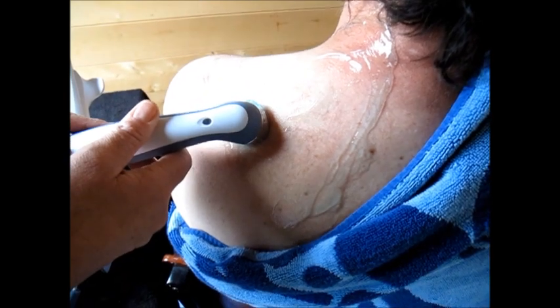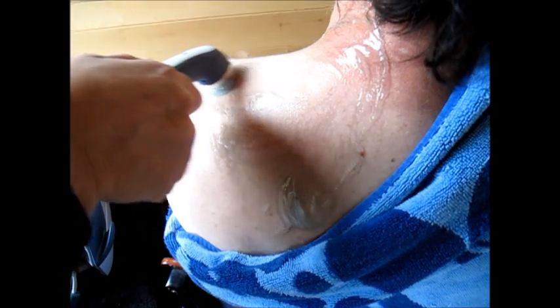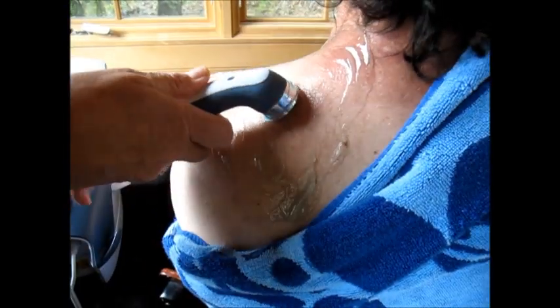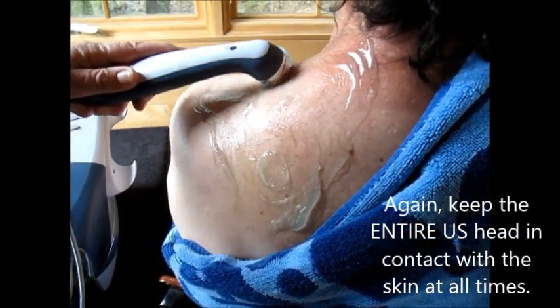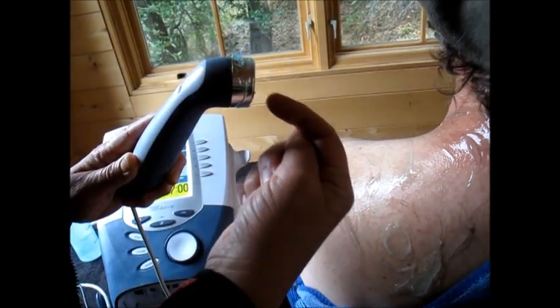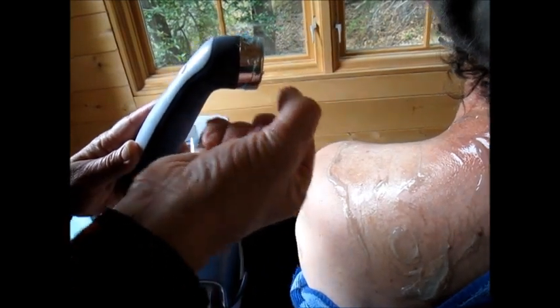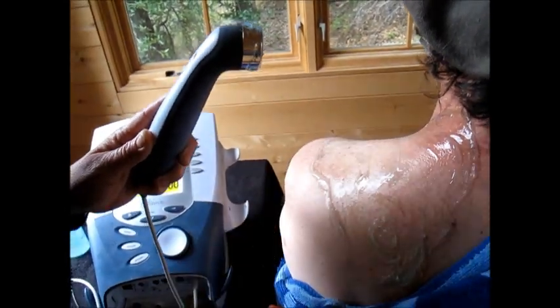If I slow too much over the bone, the patient might say 'ow' — it feels like a bee sting and lasts about a minute. It scares the patient, so be careful. Also, I don't want to lift the ultrasound head, because when I do that, I risk breaking the ultrasound head where it's not in contact, and on the side that was in contact I risk focusing all of the ultrasound vibrations through one side, which could cause a hot spot.